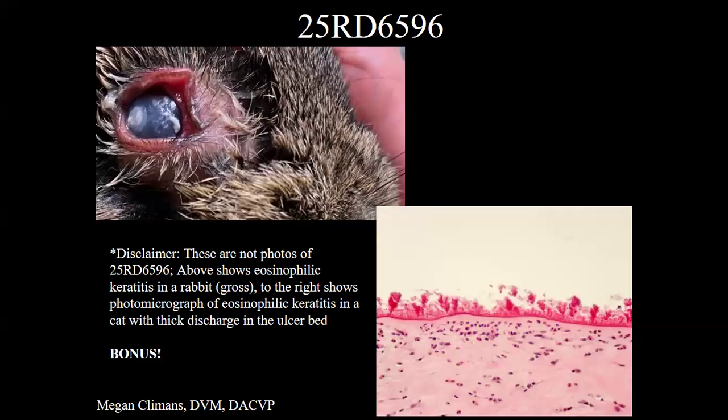I don't have a gross, but in an attempt to paint you a picture, the formalin-fixed tissue for this was extremely thickened, swollen periocular tissue, conjunctiva and orbital connective tissue. It was reminiscent to me as if you were to take a thick slab of steak that was frozen and pan fry it. So parts of it are pink and it's both soft and hard at the same time. Very, very abnormal, thickened periocular tissues.